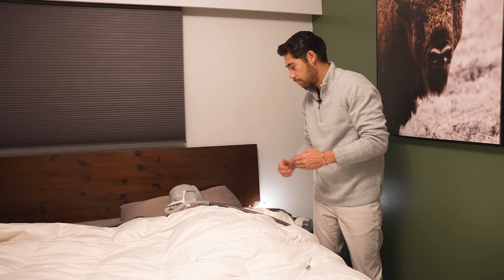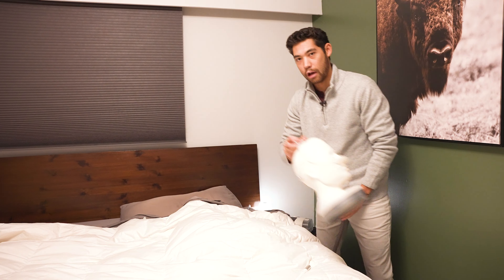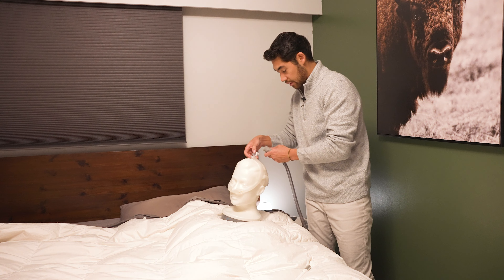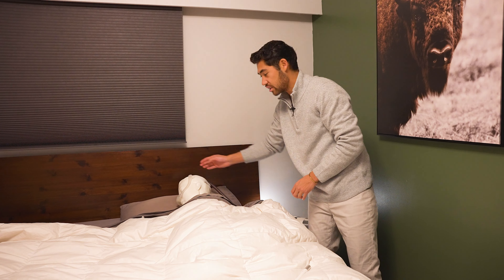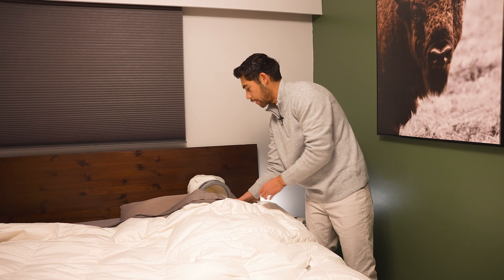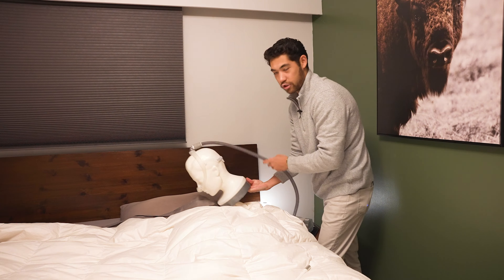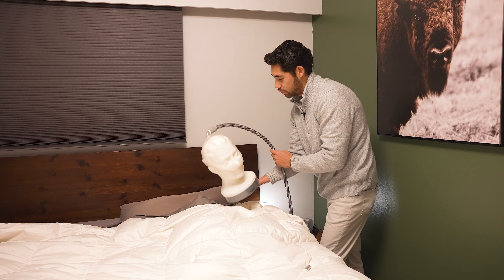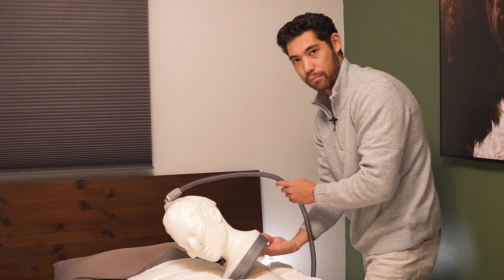One option is to change the mask. We're just gonna replace him with this guy here — this is a top-mounted mask, and it goes right on the top of the head. Because the elbow and the tube connect up top, as he rolls around, the tube can kind of stay there and doesn't impede his face. If this is him sleeping and he's rotating, the tube kind of remains in the same place.